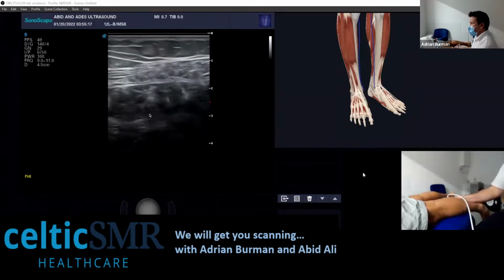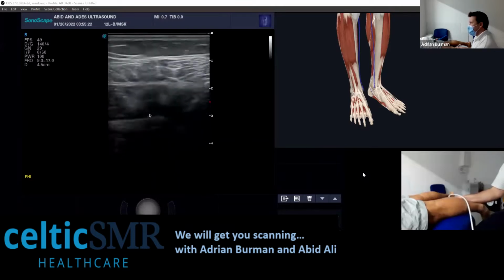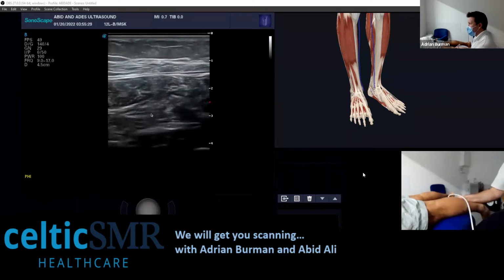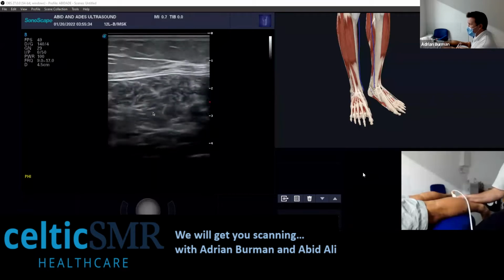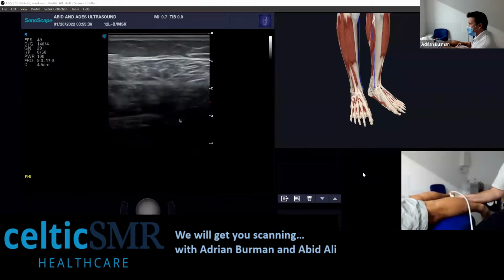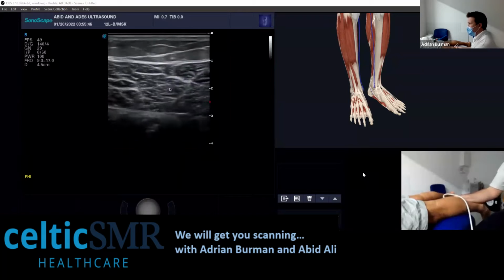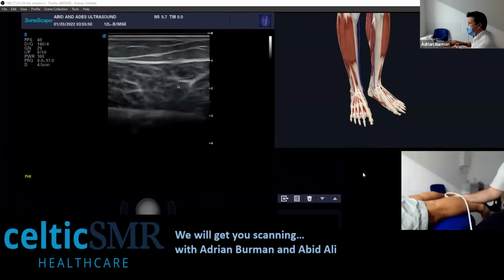And then you can put the Doppler on, and if there's any sort of activity on there, you can get sort of reactivation of these scarred areas. So just to interrogate that as well with the Doppler. But yeah, just do be careful with soleus, because it can be tricky. And the same with gastroc, really, just looking for focal irregular thickenings of hyperechogenicity for previous scarred areas.